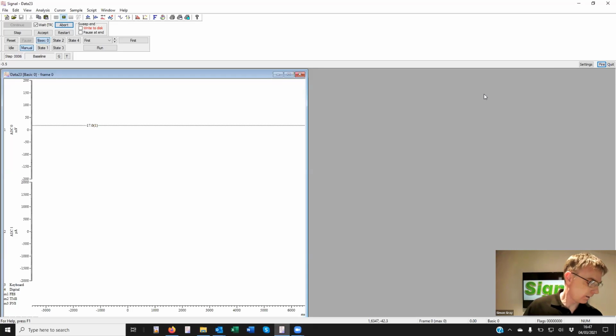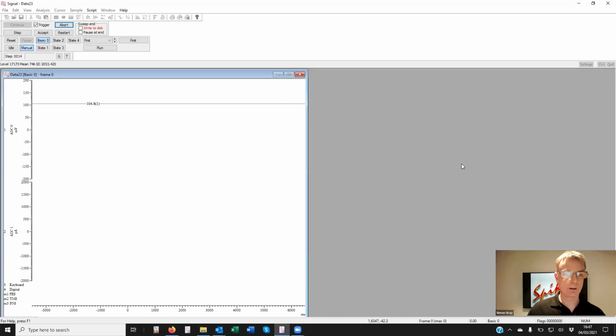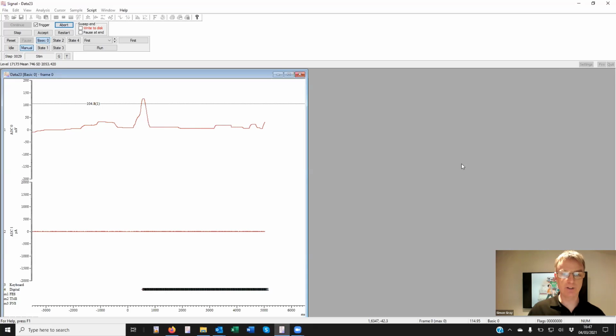So if I say fire, somebody be ready. Ready. Go. And I'm simulating the EMG here with just a joystick, rather than putting electrodes on.